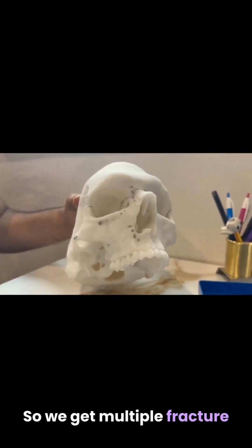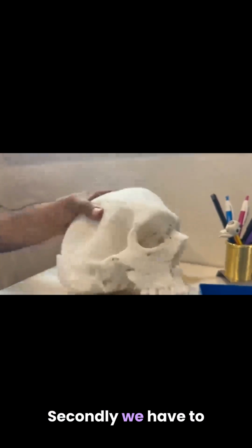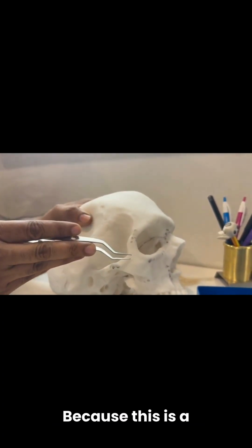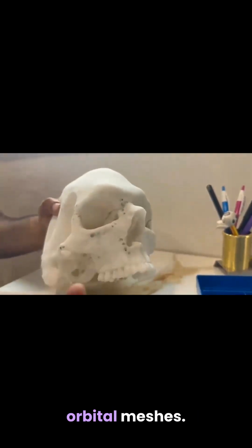So we get multiple fracture lines. We have to stabilize the maximum number of fracture lines, so that we achieve maximum rigidity and stability of this complex. Secondly, we have to stabilize the frontozygomatic suture, because this is an important parameter, and we have to restore the content of the orbit by using orbital plates or orbital meshes.